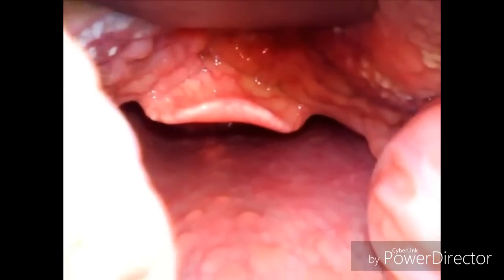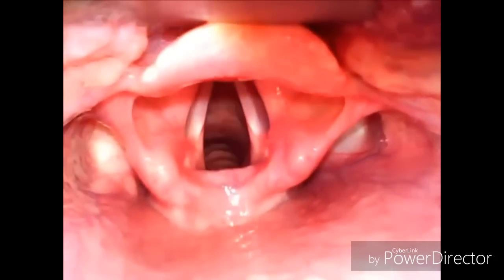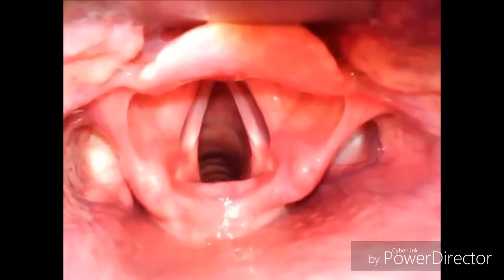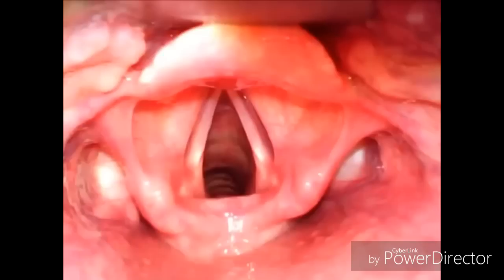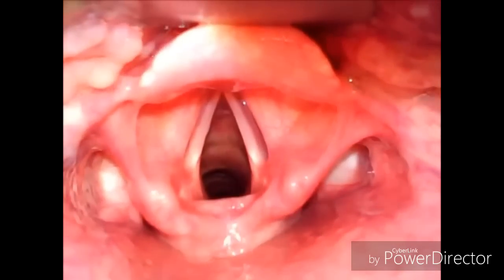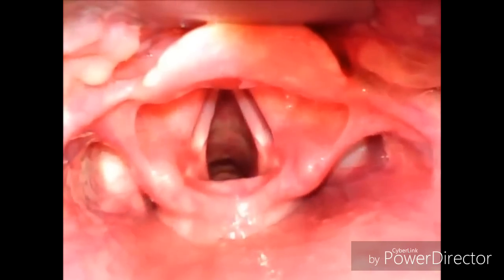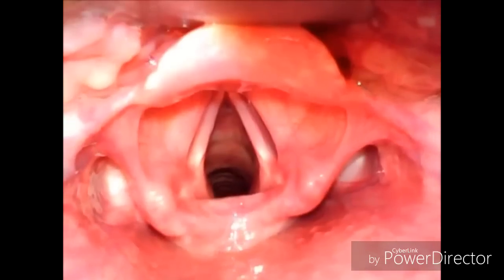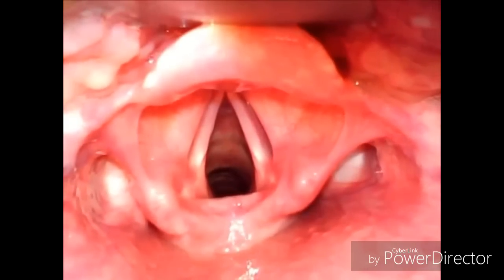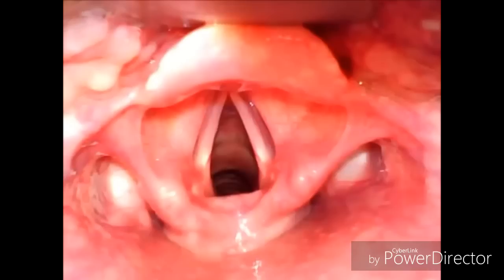You are supposed to introduce the blade just behind the epiglottis and lift it. As soon as you lift the epiglottis, you can see the opening of the trachea, characterized by the vocal cords placed laterally. You should introduce the endotracheal tube into this opening — do not introduce the tube unless this opening is clearly visible.